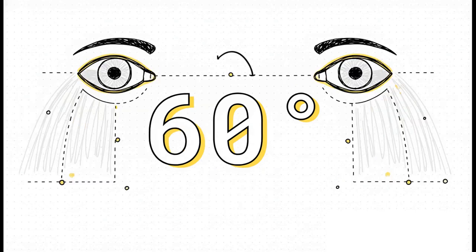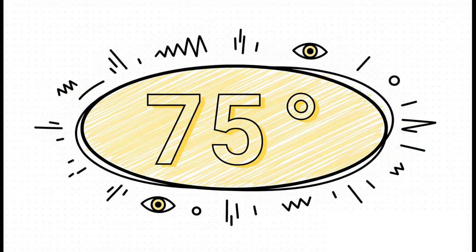Now, vertically, your brow bone kind of gets in the way, so it limits your upward view to about 60 degrees. But you can see much further down, around 75 degrees. So this whole oval shape is the invisible territory that the test is designed to map. And any change to its shape, well, that's a potential clue.